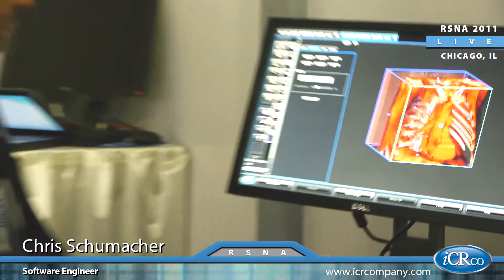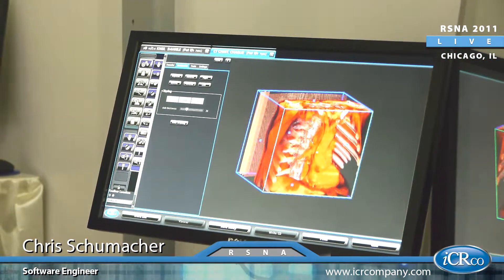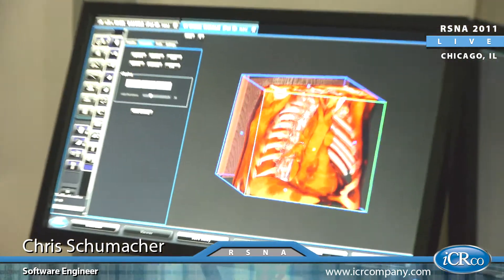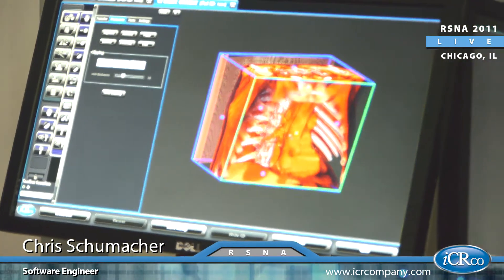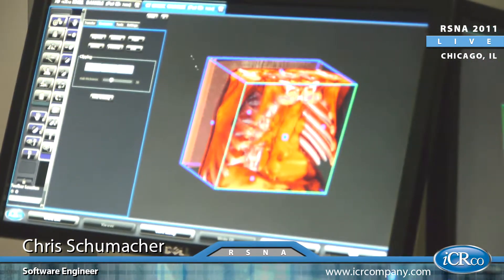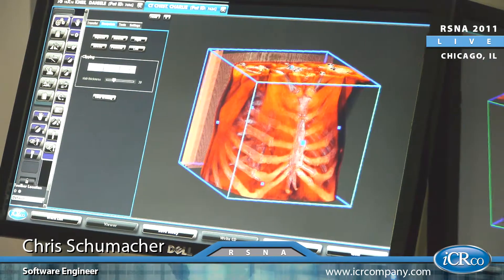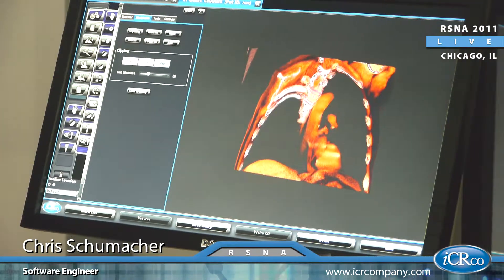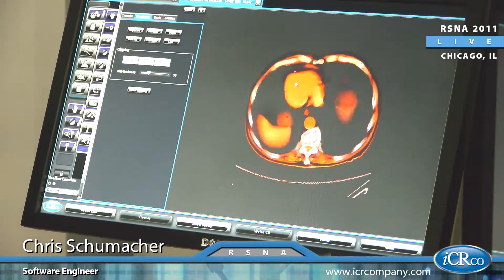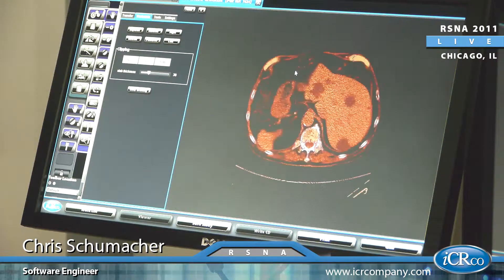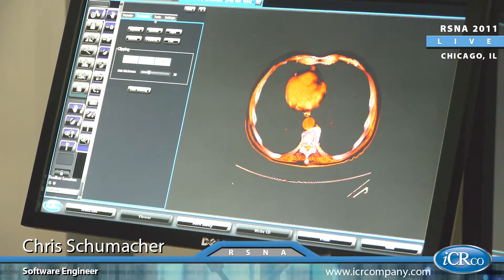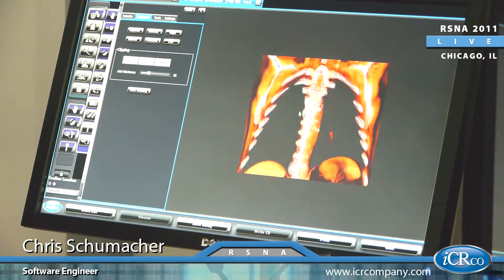In this chest we can cut in and see the heart. We're able to change the size of the box as well as the position of the box. We can do oblique cuts as well, and we can also do standard slabs — cutting in from the top or from the front.